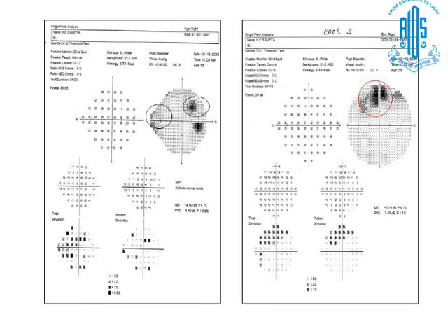You see isolated scotomas in 24-2 and an isolated scotoma in 10-2. So don't think that glaucomas appear in 24-2 and progress towards fixation. It is not like that. Glaucomas can start anywhere. So meticulous fundus examination is very, very, very important.